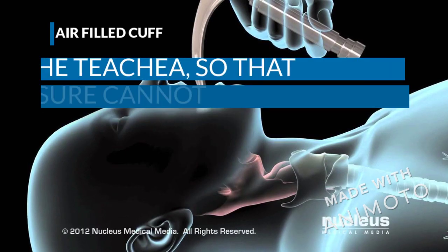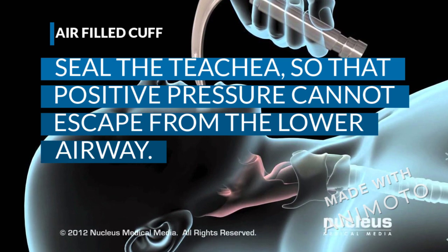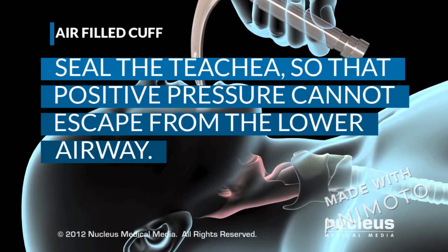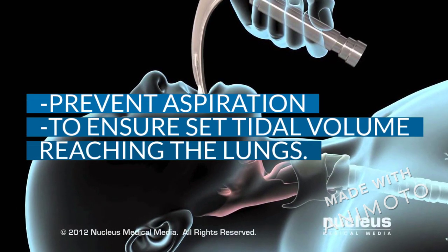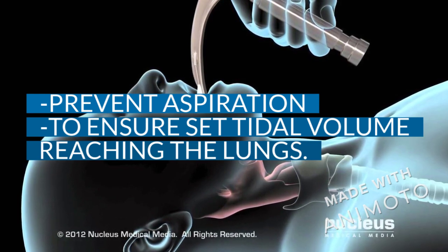The next part is the air-filled cuff. What the air-filled cuff does is it seals the trachea so that the positive pressure cannot escape from the lower airway. It also prevents aspiration, and it also ensures that tidal volume is reaching the lungs.